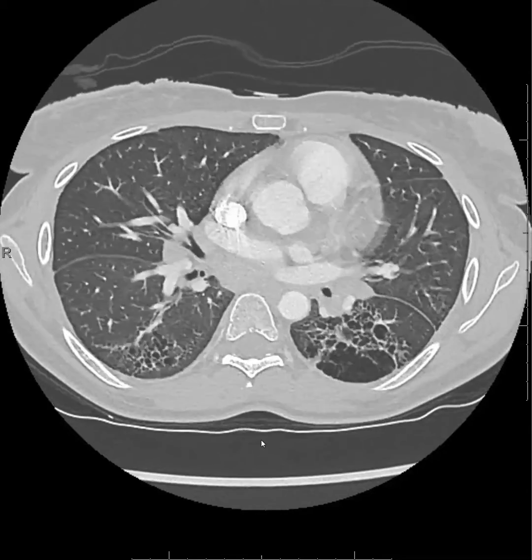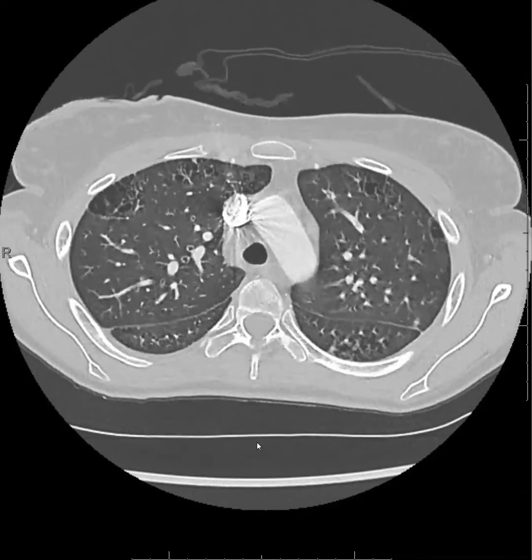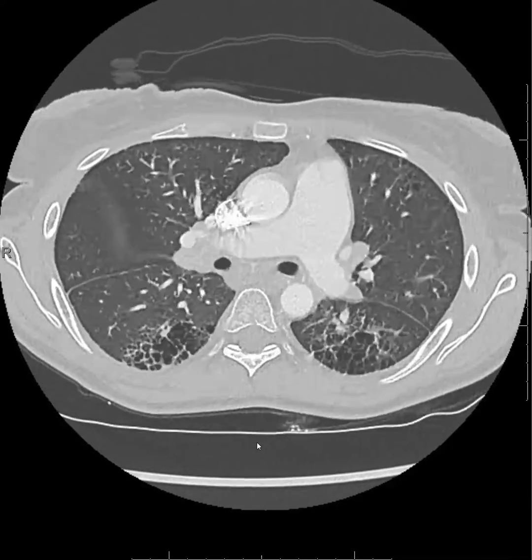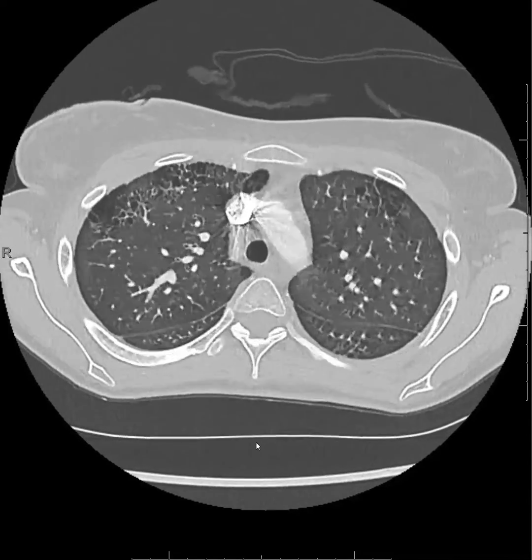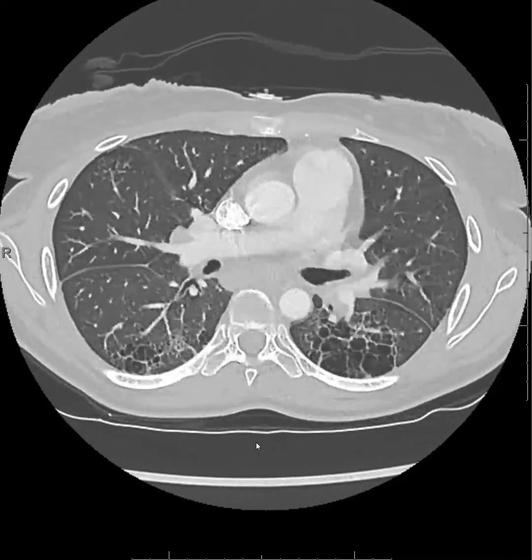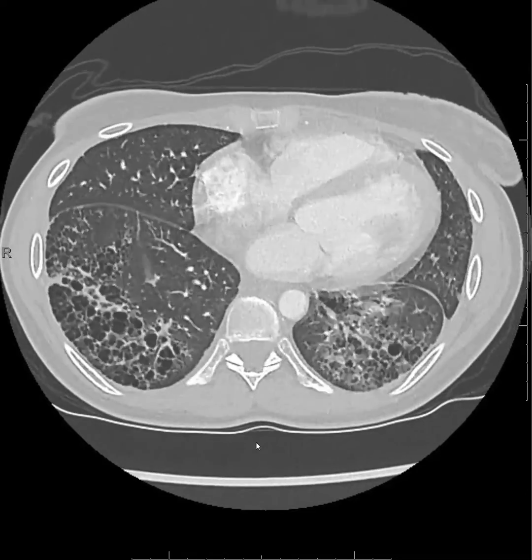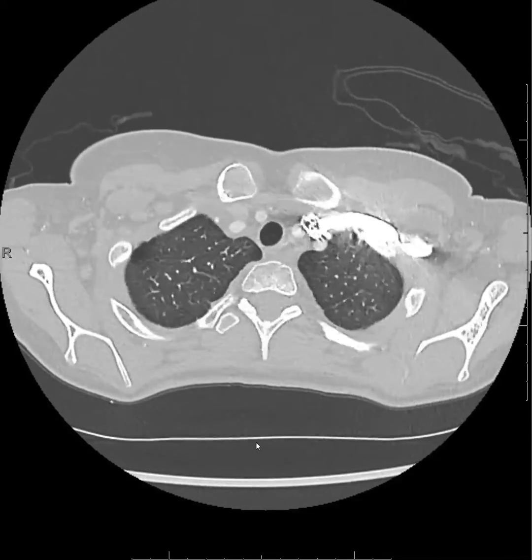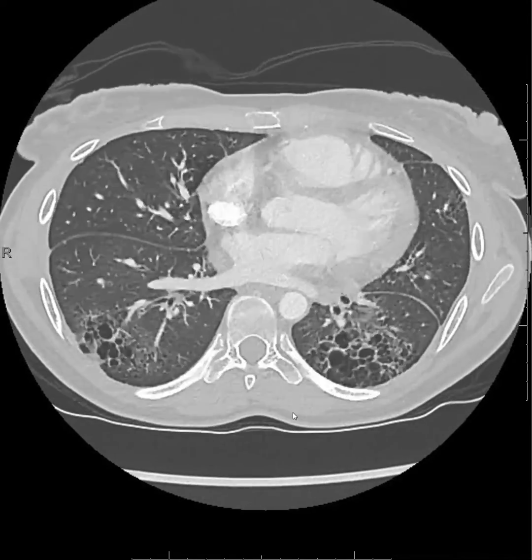It has a little bit of an odd look to it though. Almost all the fibrosis is made up of honeycombing. This is consistent with the exuberant honeycombing sign, which we published on a couple of years ago, defined as greater than 70 percent honeycombing within the areas of pulmonary fibrosis. It is strongly associated with connective tissue disease rather than idiopathic pulmonary fibrosis — which this patient indeed has.